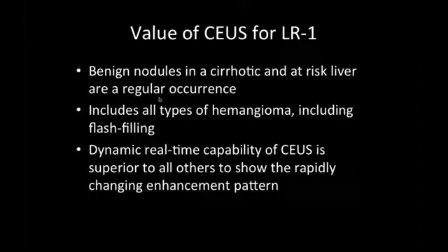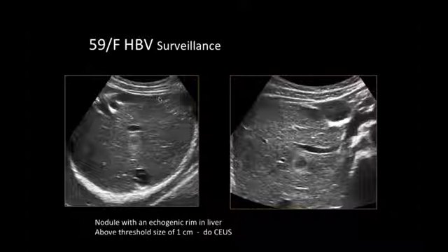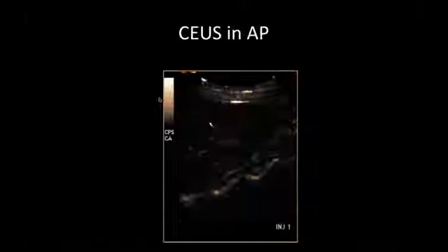Let's look at another patient with a full-blown cirrhotic liver, and on a surveillance ultrasound, he also has a hypoechoic mass in his liver. On the baseline scan, this is totally indeterminate. However, when we look at these contiguous frames in the arterial phase, we can see again filling from the periphery to the center of the lesion with multiple peripheral discontinuous nodules.